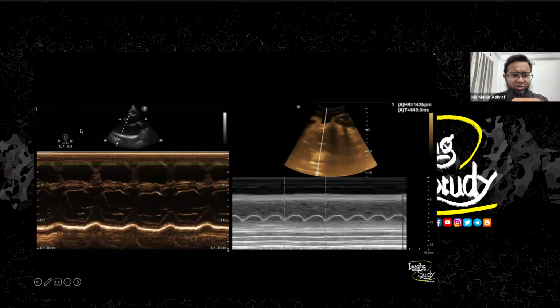So this is the picture of the cardiac ultrasound where we are using M mode ultrasound. We just changed the whole picture into a graphical image at this line level. Here we have put this line on the fetal moving heart, and you can see all the layers are converted into a graph. At the level of the fetal heart, as there is motion, you can see the movement of the fetal heart or cardiac valves. From this motion or movement, we can detect the fetal heart rate.